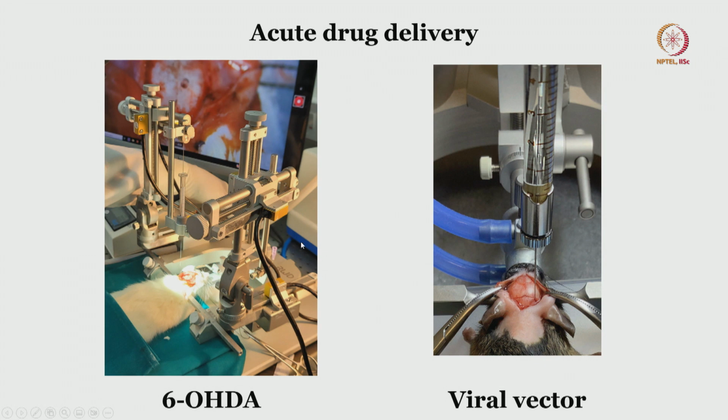That is very important, because the infusion rate matters so as not to damage the soft deeper targets of the brain. The drug has to be delivered only in the target that you have chosen, so that you will see the changes in behavior and the creation of the proper model. So that is very important.